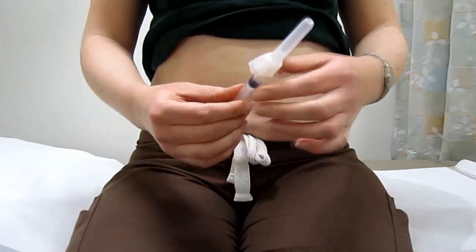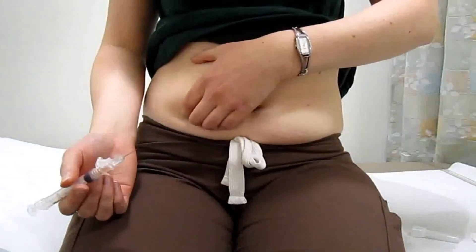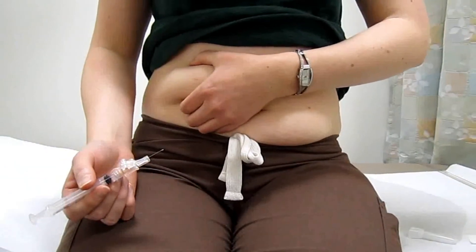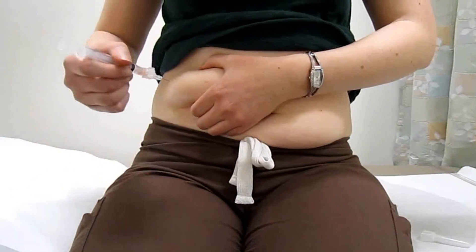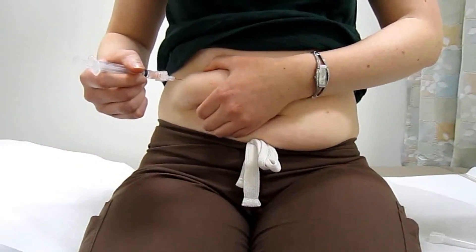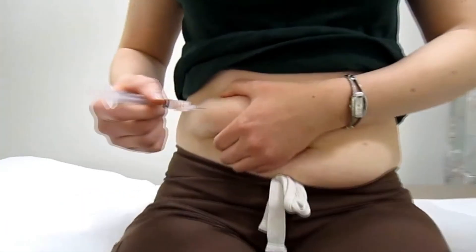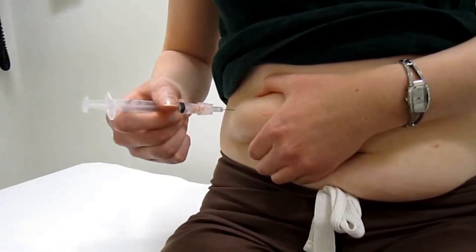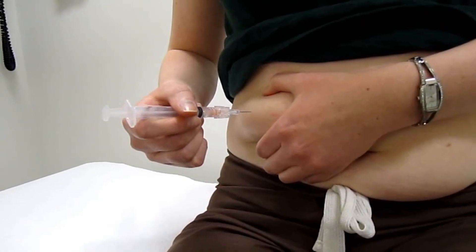We're going to take our needle and remove the cap. We're going to take the section that we've just cleaned, pinch the area up so that we can raise the subcutaneous tissue — which is the fatty tissue in between your skin and your muscle — and, in a darting motion, quickly dart the needle into the abdomen at a 90-degree angle.